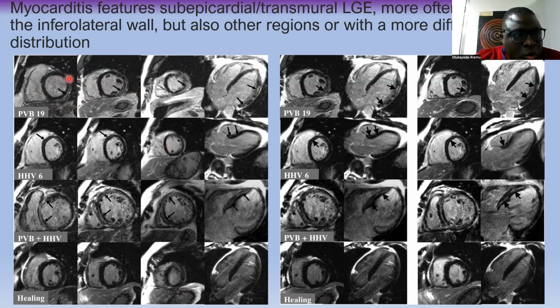We can see it on the inferior part, the posterior inferior part of the myocardium. Same here, and then we appreciate here that it is from the base almost to the apex. It is almost transmural as it's here. Look at the stripe that I was talking about the other time. So this, we cannot call linear midwall. It is linear in shape, but if you look at it across the myocardium, you can see that it's almost transmural. Same goes with the one on this panel here.